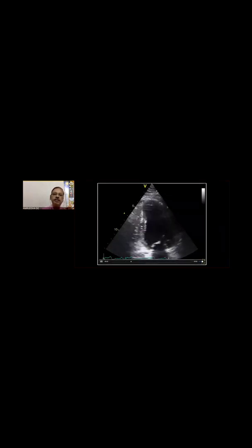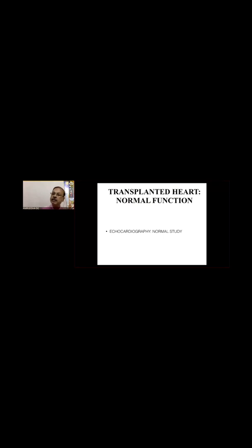And if you see the bullseye, the apical strain is almost 0. So this is absolutely a scar. And the other areas, the anteroseptal areas, are hypokinetic and otherwise fairly well. So this concludes ischemic heart disease.